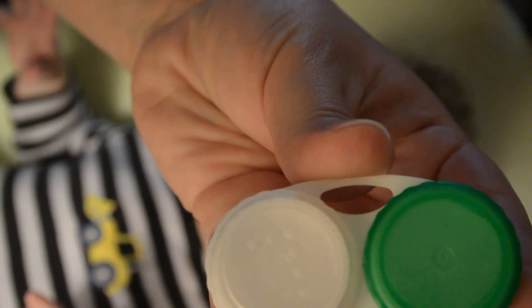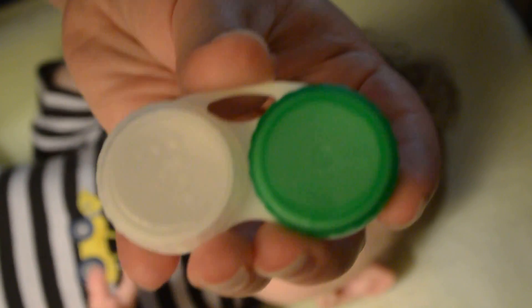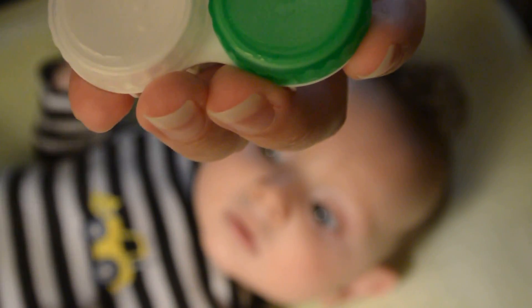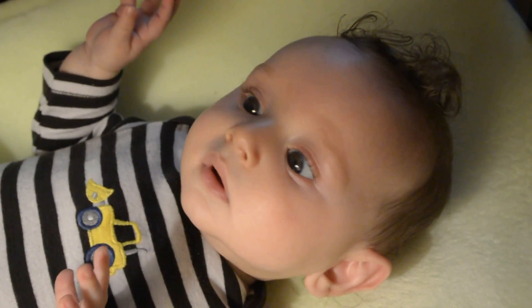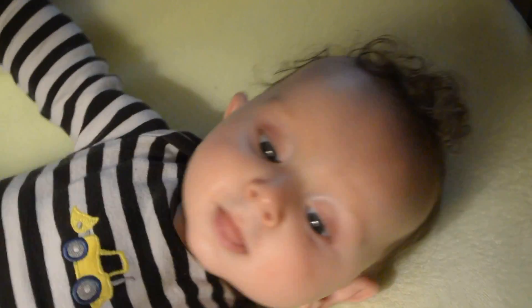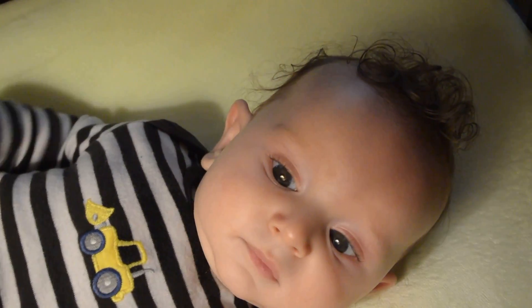Because he wears contacts in both eyes, I first make sure that I am going to put the correct lens in the correct eye. You should always start with the same eye so you get in the habit and you do not mistake which eye you put the contact lens in. So I always begin with the right eye.